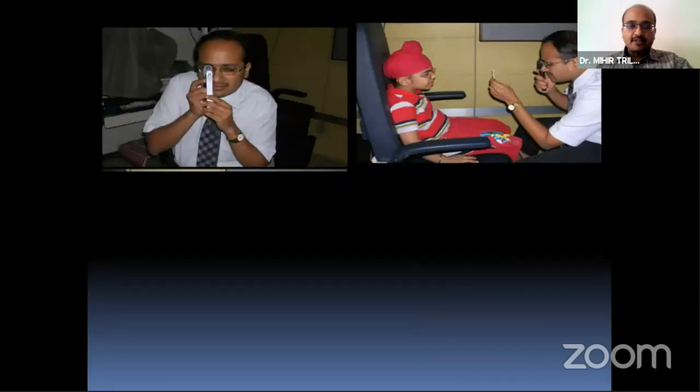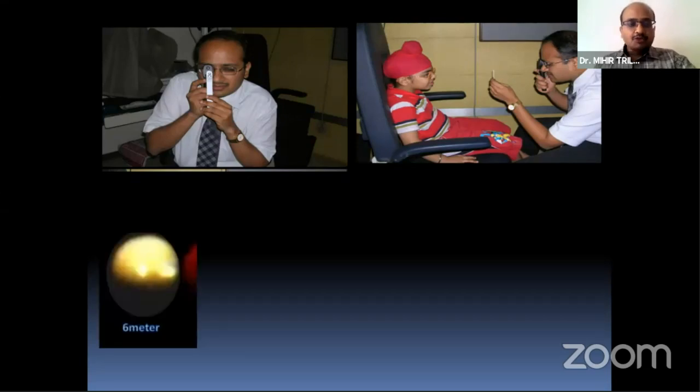So here, the test is relatively simple, can be done on both eyes simultaneously, significantly faster, and works better in patients having large astigmatisms. You just need to look at the patient's red reflex while the patient is being asked to look at a distance wearing an optical correction. It could be a dark room or it could be a reduced illuminated room.